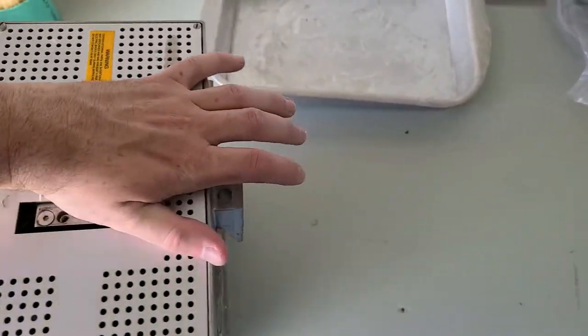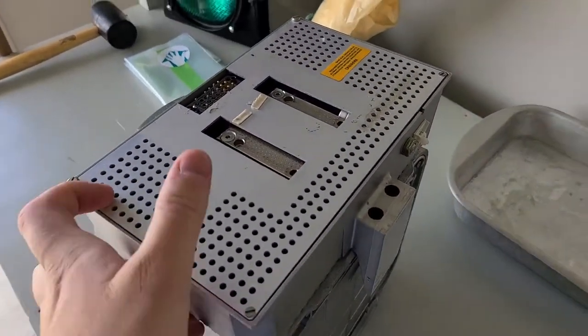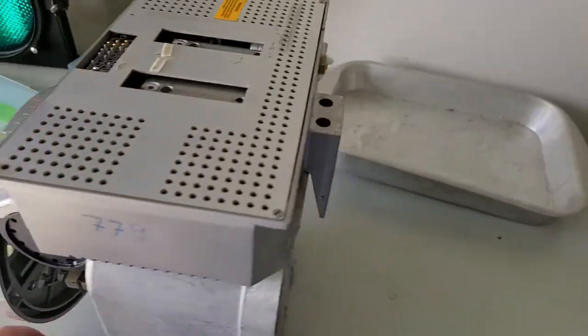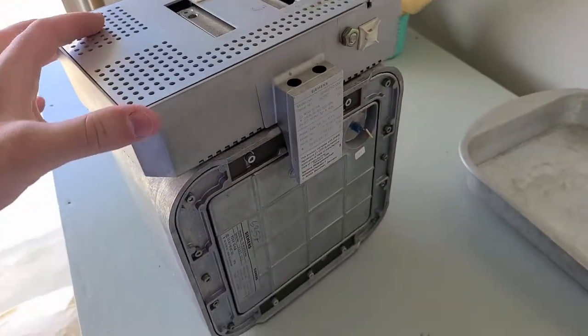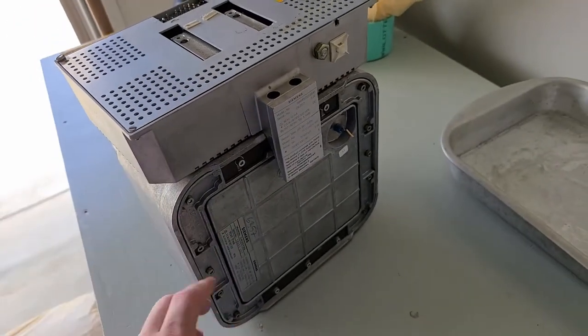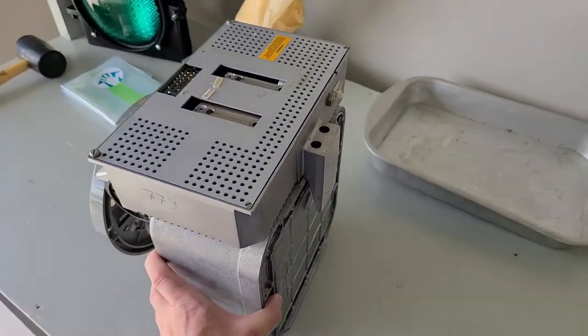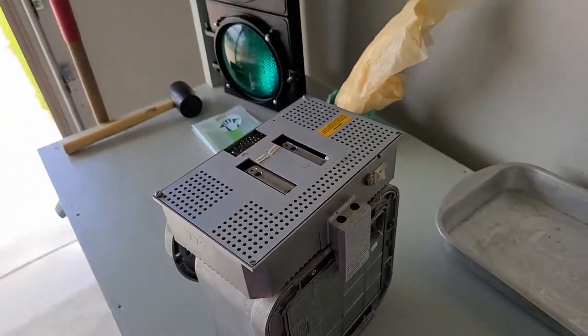And I'm going to go ahead and just take off the external stuff here first and just kind of show you that. And then once I get everything off, I'll go ahead and set the camera up and take the plate off here. So we can go ahead and take out the x-ray tube and check out the transformer inside.